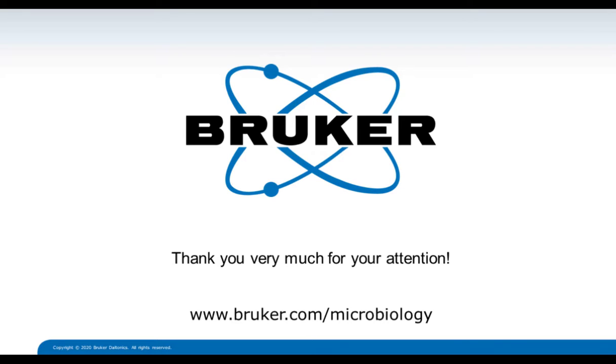Okay. So our next question is, can the MBT shuttle be used for drying all, including ID-related MALDI targets? Indeed, this is one of the aims we have. It's not yet validated for in vitro diagnostics, but we have tested quite a number of samples already with very promising results. And one of the intentions is indeed, as the lowest effort application, to use it to accelerate and also to standardize the drying process before identification.